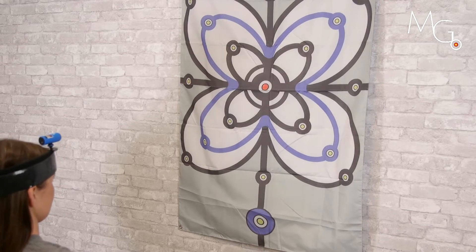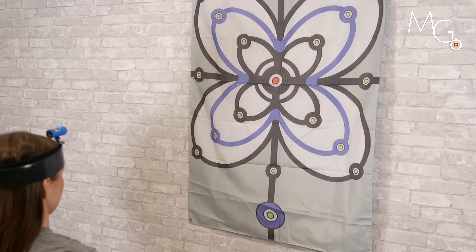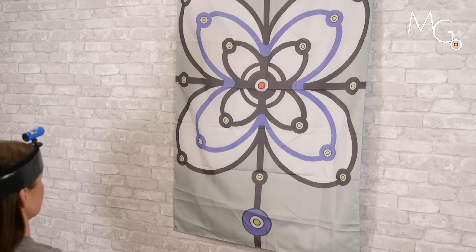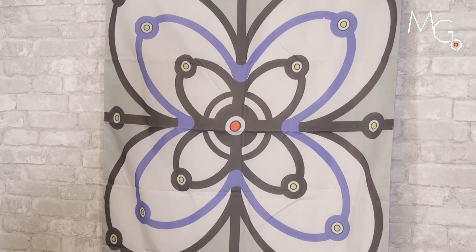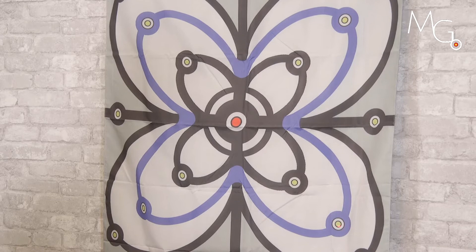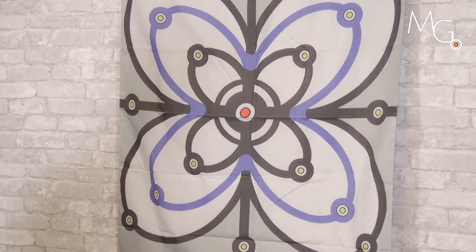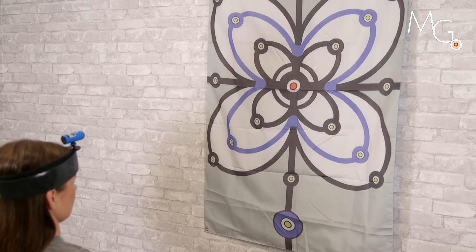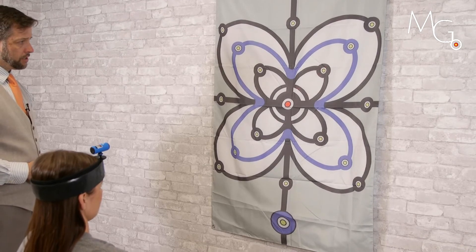We can work on motor control patterns with infinity signs or flower patterns staying on the outside. You can also do off-axis diagonal patterns up and to the right, and through the center down and to the left.